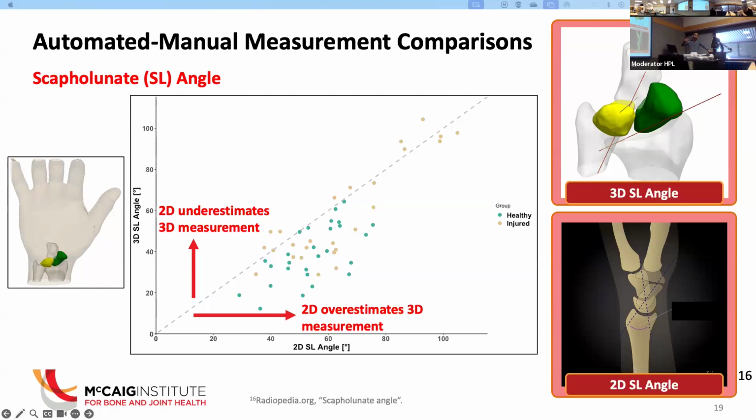I could really get into the depths of this, but the Spark Notes version is that if we can better understand the rotation of the bones, that will help us maintain more normal, healthy kinematics, as opposed to just reducing that interval, which is what we currently have with just a screw. If we can account for that rotation of the bones, it would allow for a more effective surgical technique.